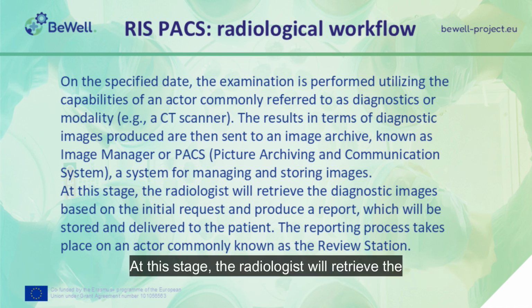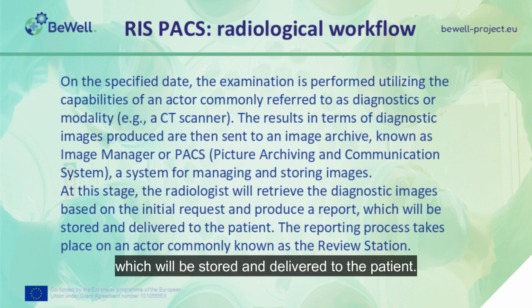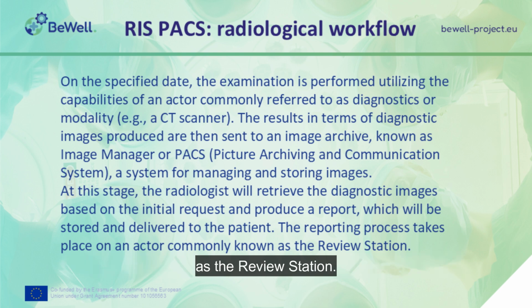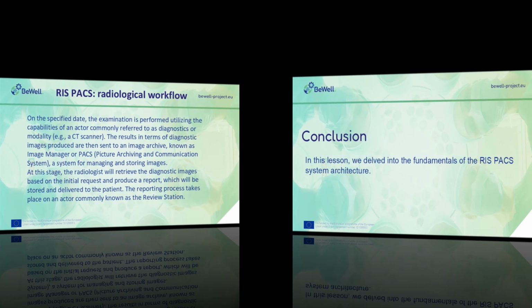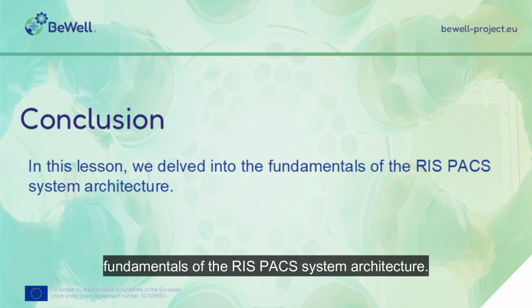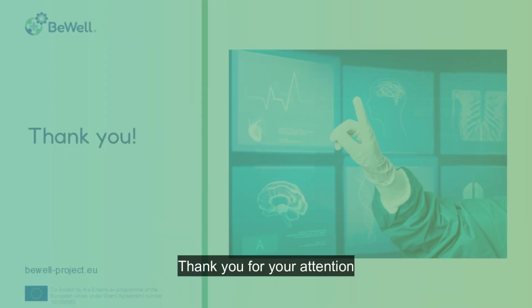At this stage, the radiologist will retrieve the diagnostic images based on the initial request and produce a report, which will be stored and delivered to the patient. The reporting process takes place on an actor commonly known as the review station. In this lesson, we delved into the fundamentals of the RIS-PACS system architecture. Thank you for your attention.